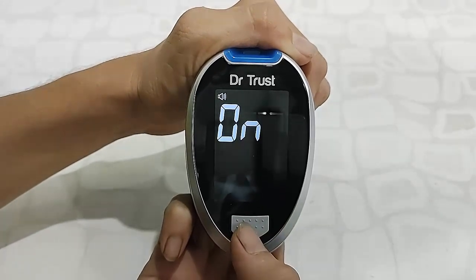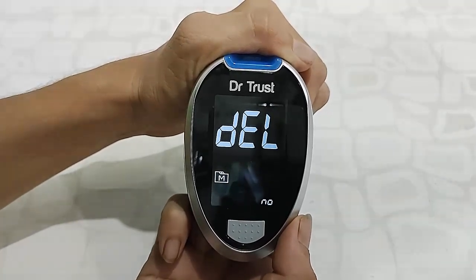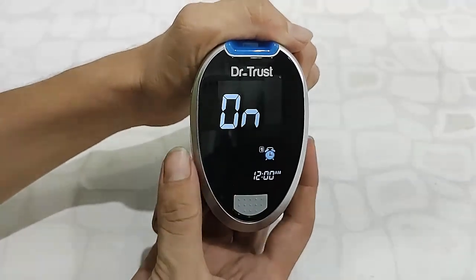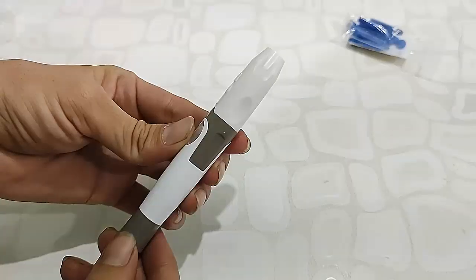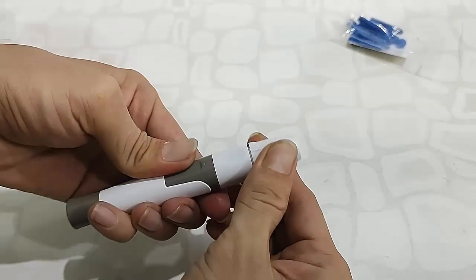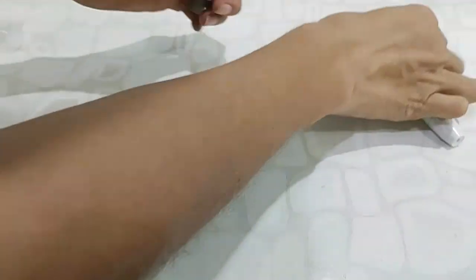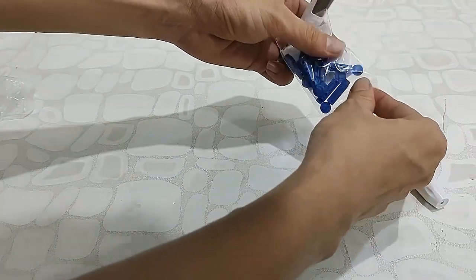You can set the alarm and beep or alarm sounds. Now let's see how to use it. First, you need to prepare the lancing device. Just remove the upper cap, then insert the lancet needle into the lancing device.